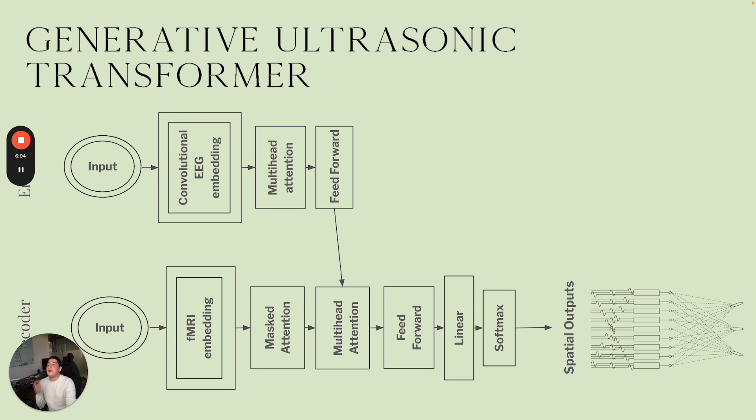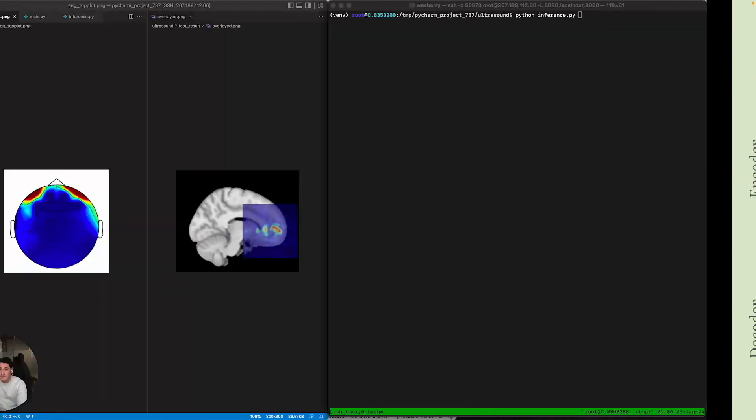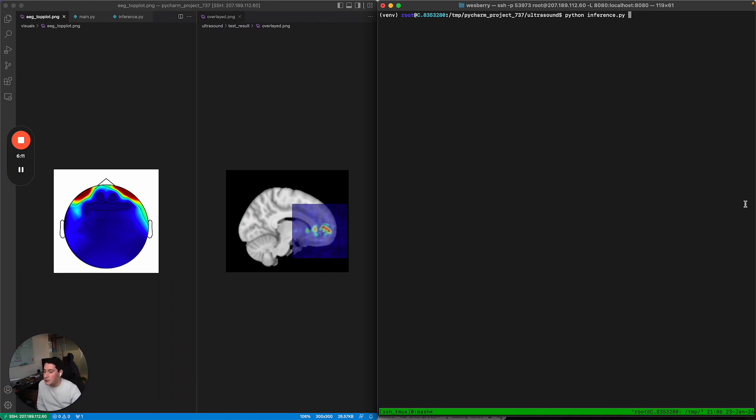Now, I don't want to just show you a diagram. I want to show you what we've built. I want to show you Morpheus 1. So here we're in a terminal. On the left, you're going to see the EEG, which would be coming from the halo headband on your forehead. And then on the right, you're seeing in simulation software, the outputs of the pulses in the prefrontal cortex. Now, I'm going to click enter here.